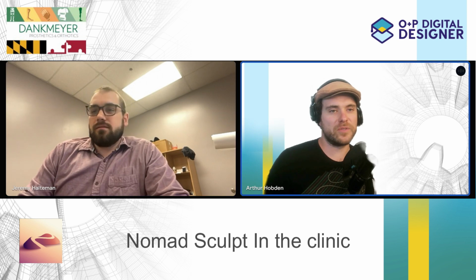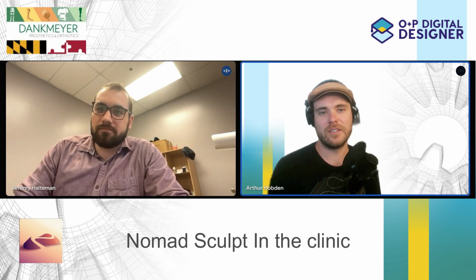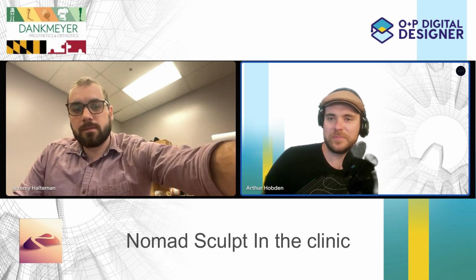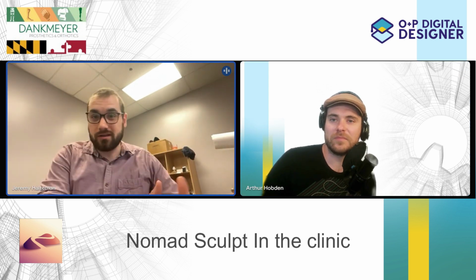So voxels, for those of us who don't know, are like 3D pixels, right? Right, it's a volumetric reading on a solid. So Nomad works in voxels? It can work in voxels. It can also work in mesh. We started working almost exclusively with voxels, and now we don't do that as much. Our workflow has definitely changed over time. The mesh tools are way better now than they used to be.